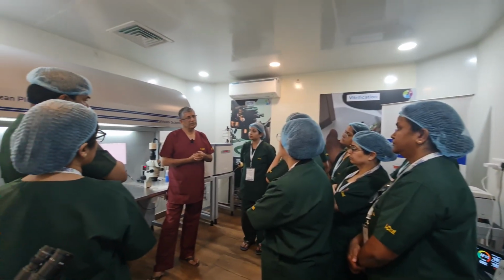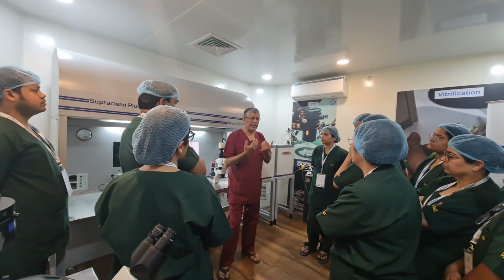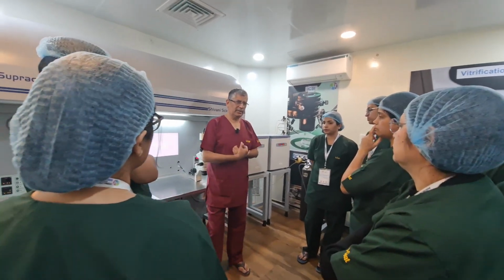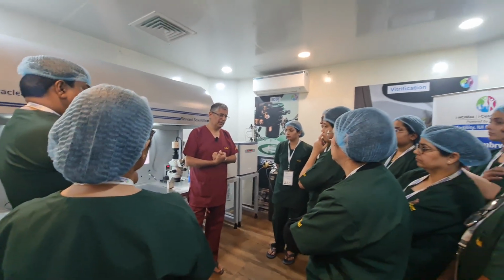Oil will always give you more volatile organic compounds. So we use a water soluble paint. Acrylic, epoxy or latex, water soluble paints.